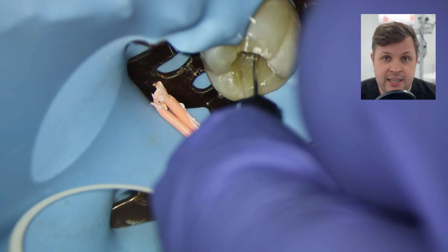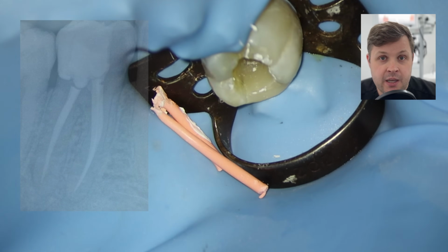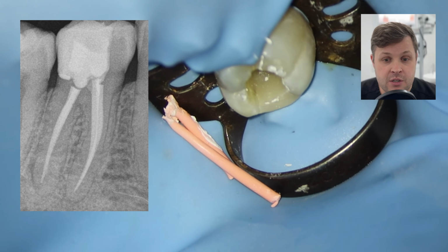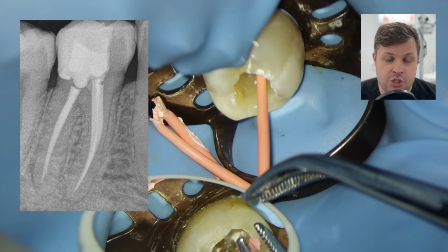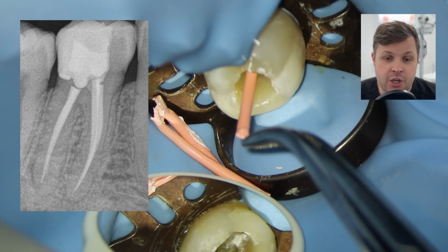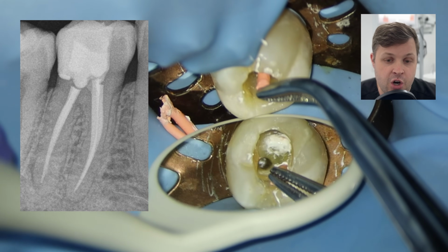And then as we have a little look, we can see down the mesiolingual canal that actually fills up as well. And when we look at the post-op radiograph, again, it looks really nicely shaped, really nicely filled, no voids, but it is short of the radiographic apex. And as we'd mentioned before, sometimes you're going to get a little bit of sealer puff out the end if you do push it to length. Sometimes you're not going to get that.